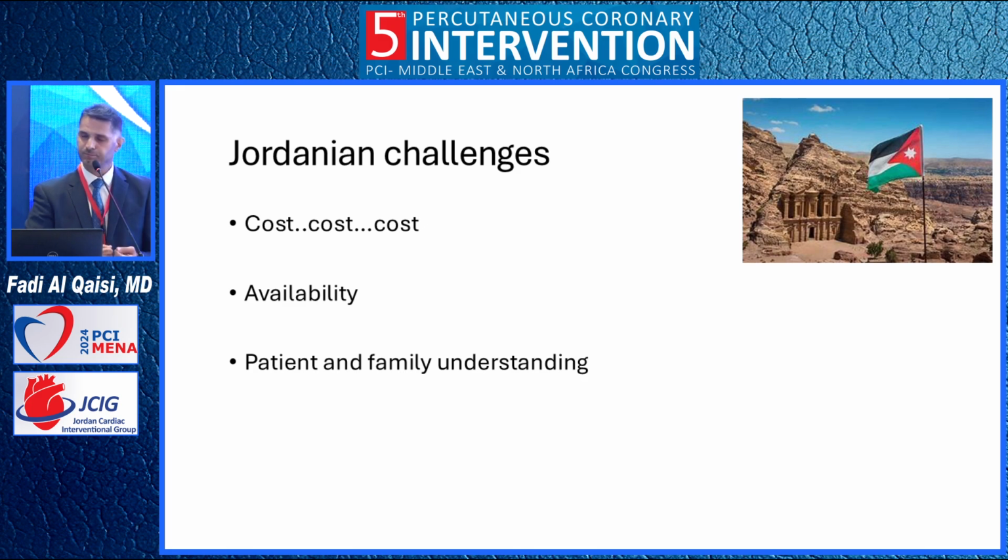The other thing is availability. Unfortunately, we have few devices of rotablation or lithotripsy, and that's why they are sitting there. The agent has to move them from one hospital to another, so you go in to work on the patient, and you have to take them off the table and explain why you did not work on the artery because of the calcium and this and that. And then you have to make sure the family understands.